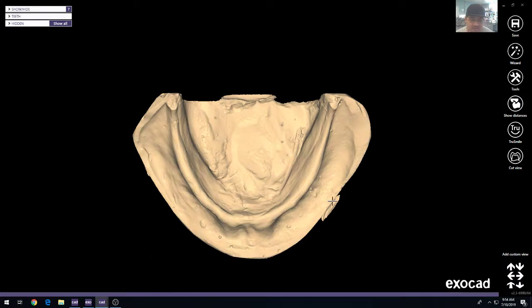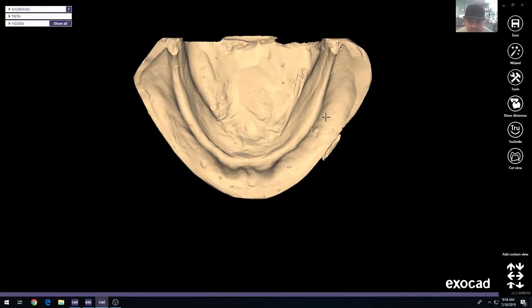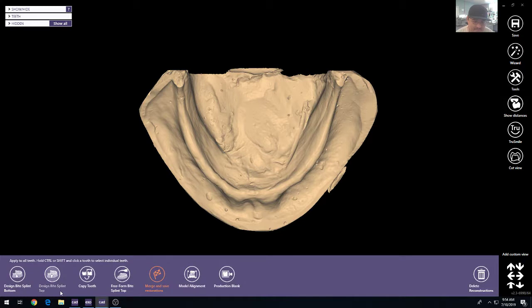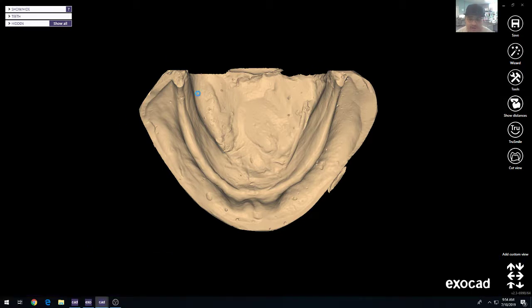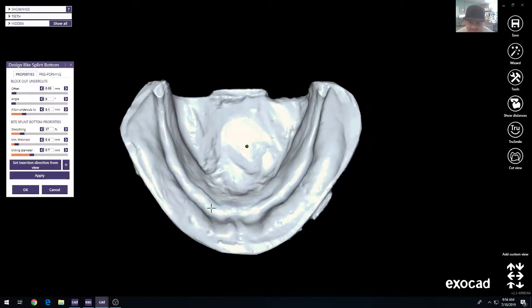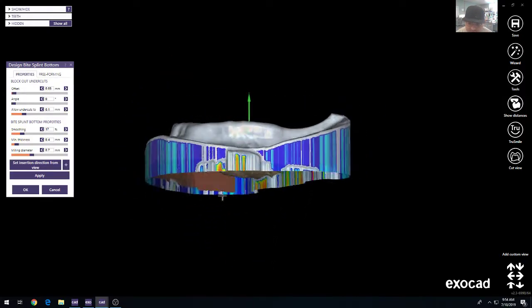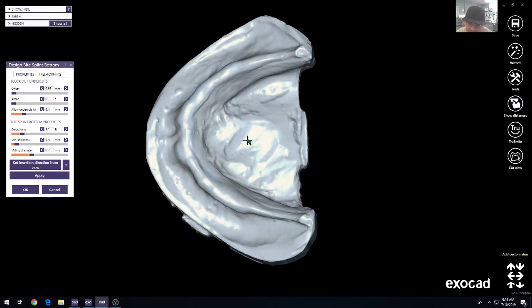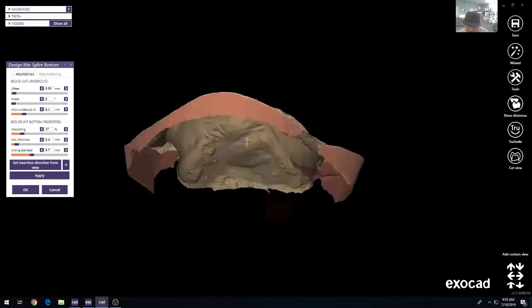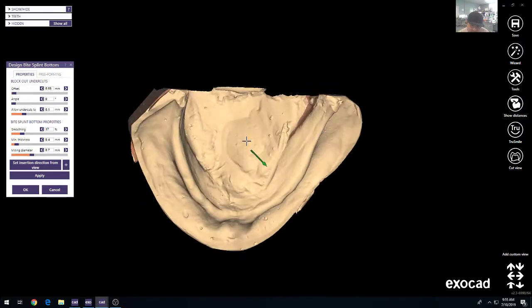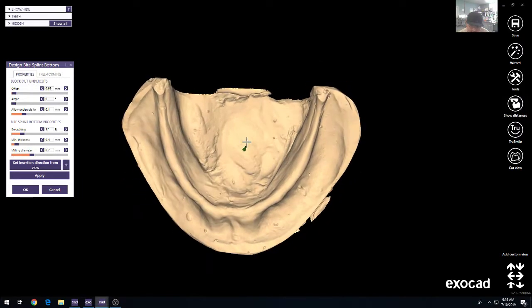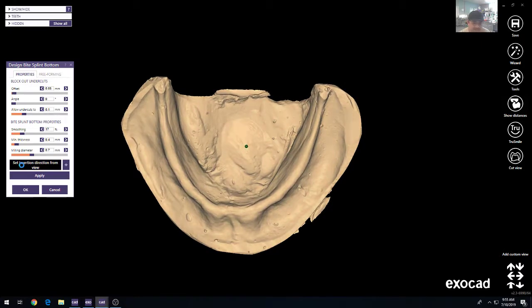So basically what you can do is come in here to the software. The first step in the process is to design the Bitesplint bottom and how it interacts with the stone model. You're going to be giving that an insertion direction by setting it with the arrow or by setting it with your set from view. Basically from there you decide on the offset.